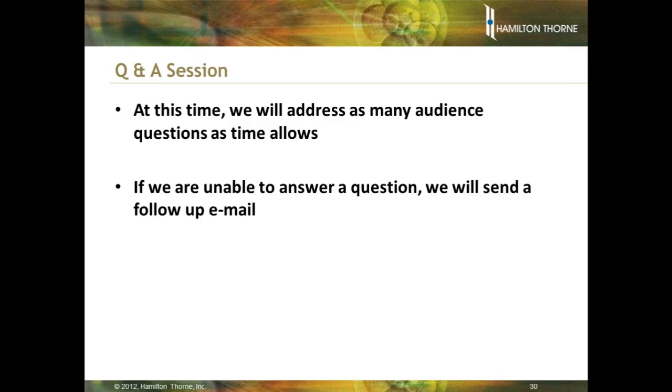I'm not aware of any risks or any changes that the laser would create in the media that would pose a risk to the embryo. In fact, I think one of the major advantages of the laser system is it's so rapid and easy that it does not require you to make embryos go from the hot tub into the swimming pool, if you will, changing media and changing the environment so the embryo has to adapt to something different. Although brief, you can hatch the embryo in your culture dish and put it back in the incubator within less than a minute, and not change the environment substantially at all. So again, I advocate leaving the embryo alone as much as possible.